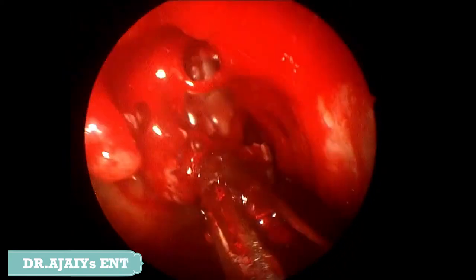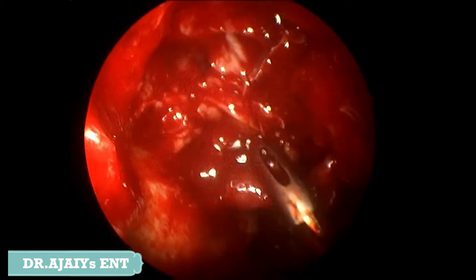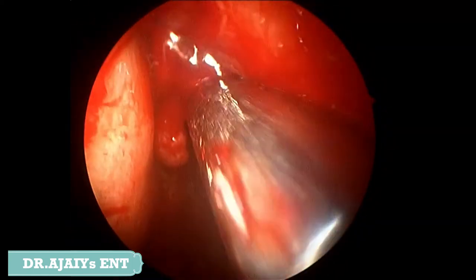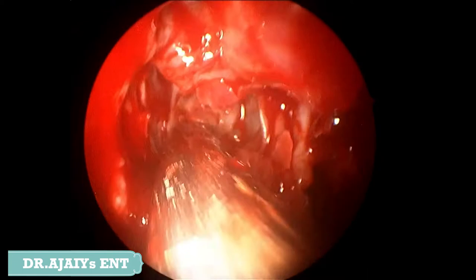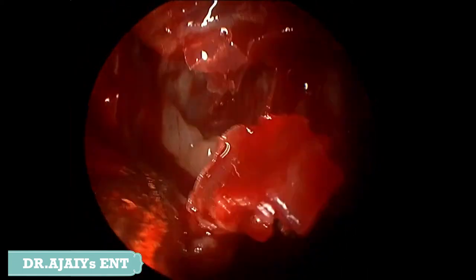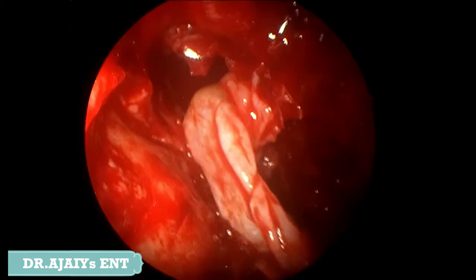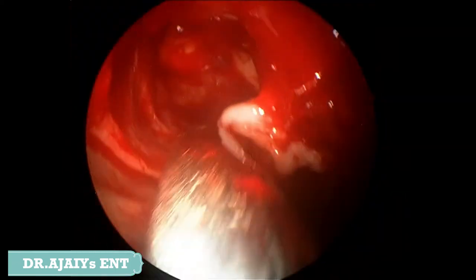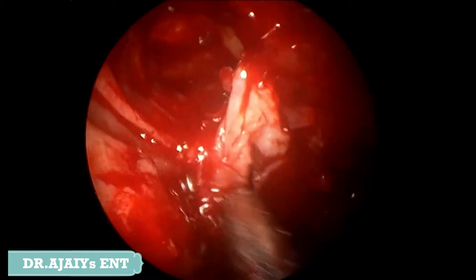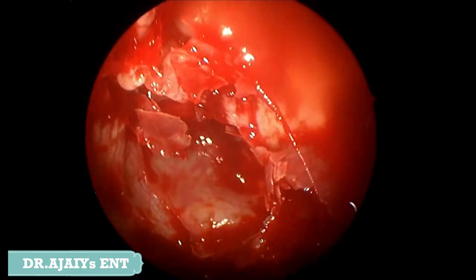Once we removed the bulla ethmoidalis, we could see necrotic contents along the ethmoidal area. Going into the ethmoid, we could see polypoidal mucosal thickening along the ethmoidal area, and the bones were necrotic. We removed the polypoidal contents from the ethmoid area. The posterior ethmoid and remaining parts were normal with no involvement. We removed the inflamed mucosa and necrotic contents from the ethmoidal walls.